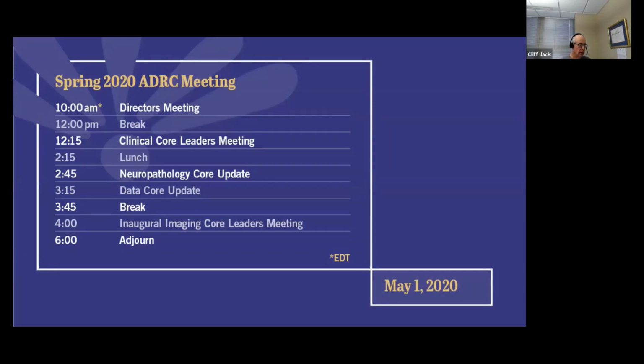But I don't think we're going to mandate that you have to use a certain head coil because it may be very difficult to access that coil or whatever. These are site-specific things. What we want, of course, is the best equipment at each site for SCAN and for the ADC protocol. So if you have an old-fashioned 8-element coil, and then you also have a nice hot 32 or 64 channel coil, of course we'll tell you to use the 32 or 64 channel coil.